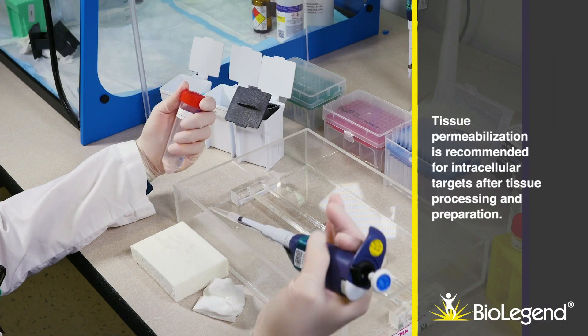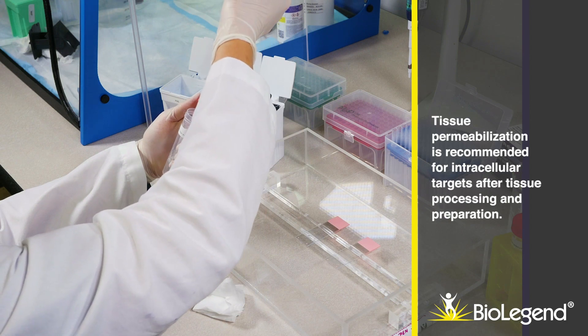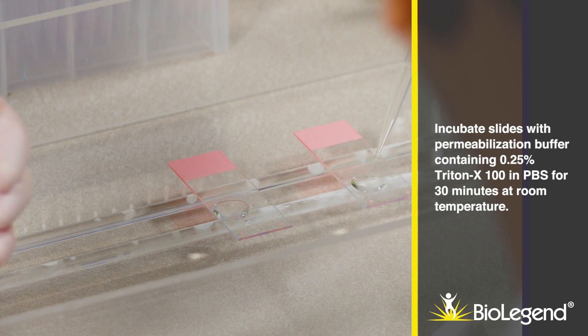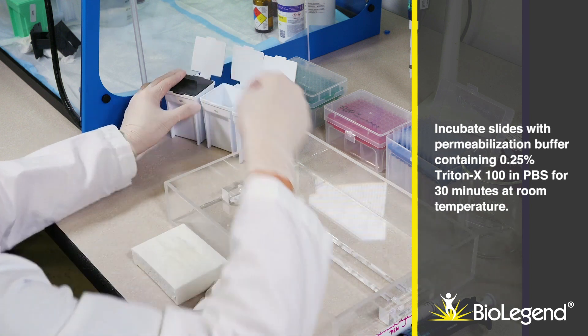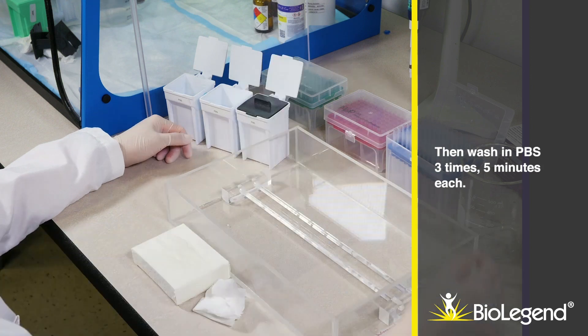Tissue permeabilization is recommended for intracellular targets after processing and preparation. Incubate slides with permeabilization buffer containing 0.25% Triton X-100 in PBS for 30 minutes at room temperature. Then wash in PBS three times, five minutes each.